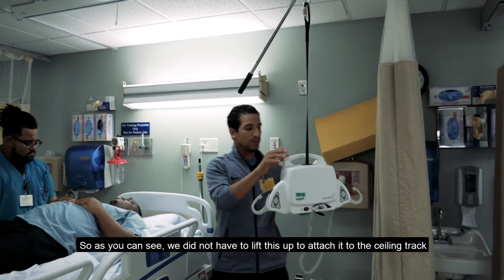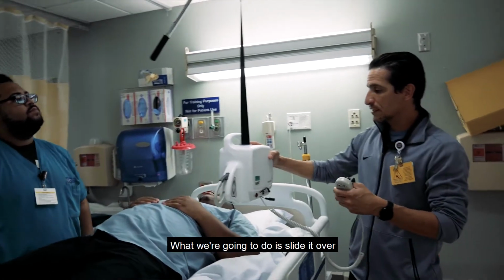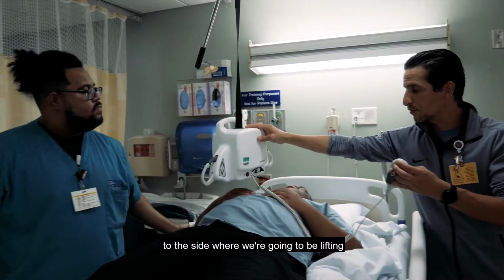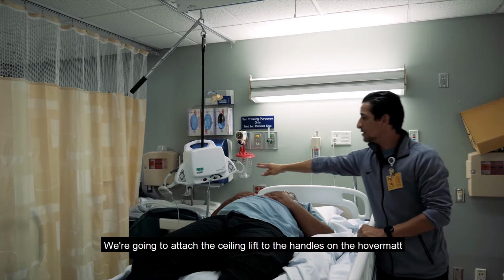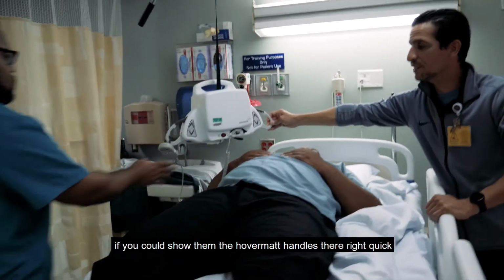So as you can see, we did not have to lift this up to attach it to the ceiling track. What we're going to do is slide it over to the side where we're going to be lifting. We're going to attach the ceiling lift to the handles on the hover mat. If you can show them the hover mat handles there right quick.